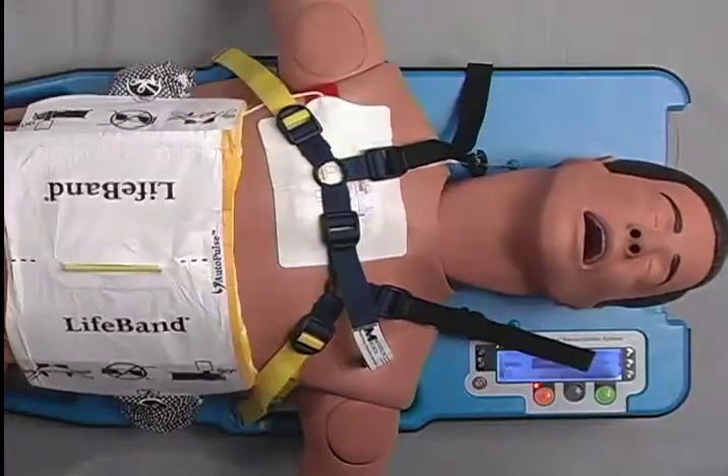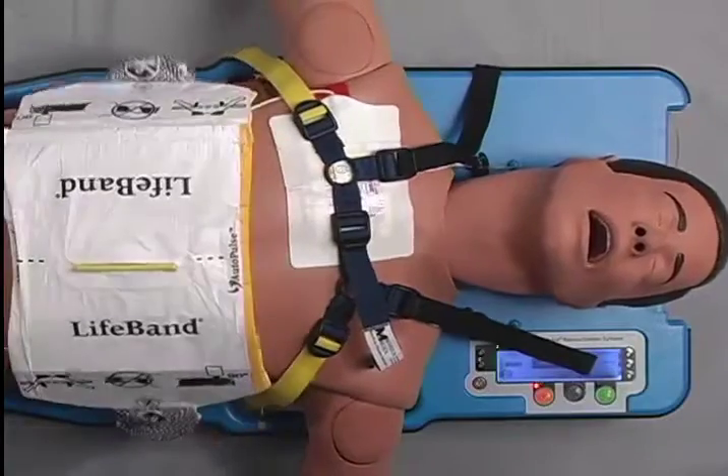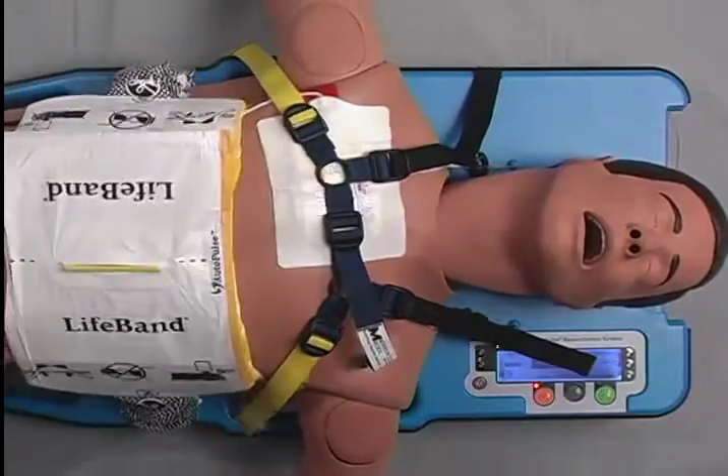Then partially tighten the black straps near the patient's head. It is critically important to ensure that the shoulder restraint in no way impedes chest wall recoil. If the shoulder restraint is too tight, it could negatively impact proper autopulse operation and potentially reduce blood flow.